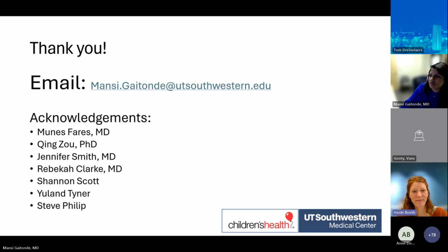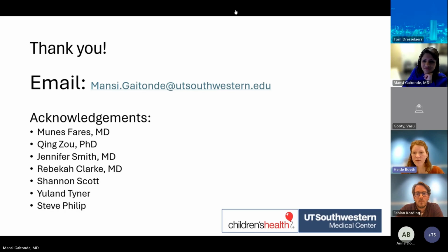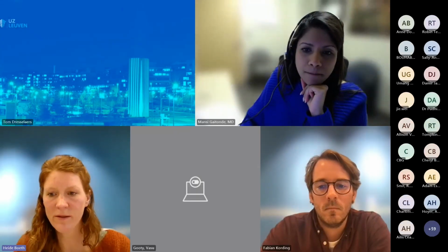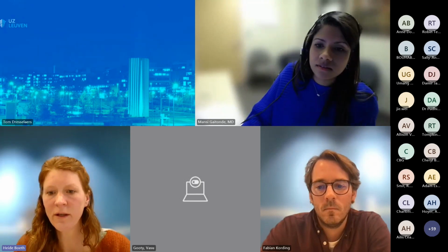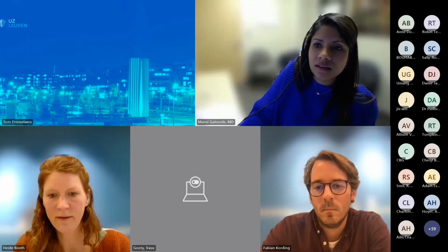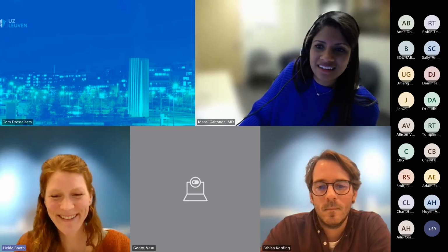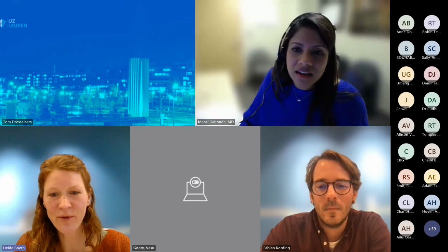Thank you so much, Mansi, for this insight. There is a question for you that we directly want to raise. Can you give, Mansi, a little bit more details on the sequence parameters, like slice thickness, field of view, number of phases? You are muted. Mansi, you are muted, yeah.